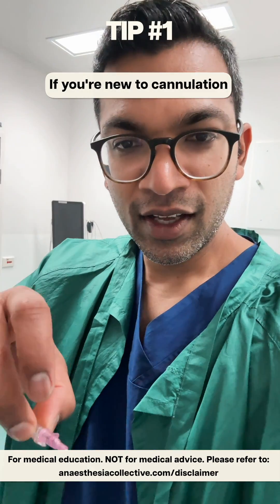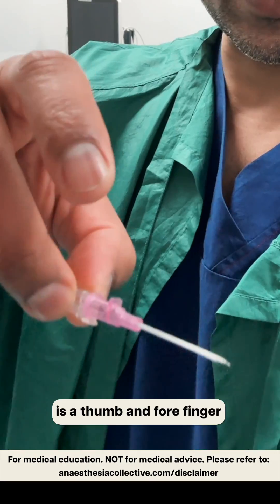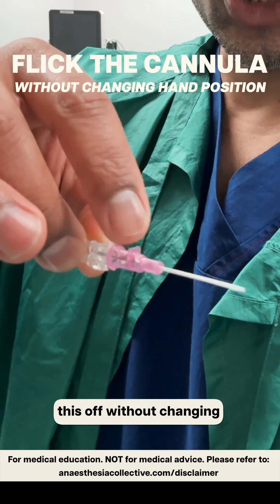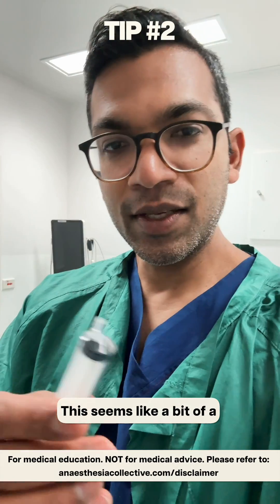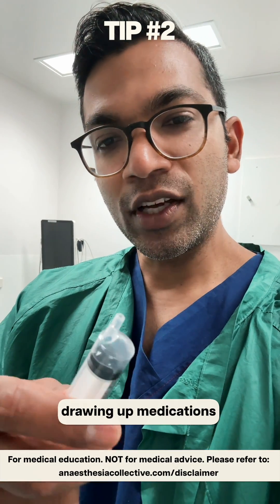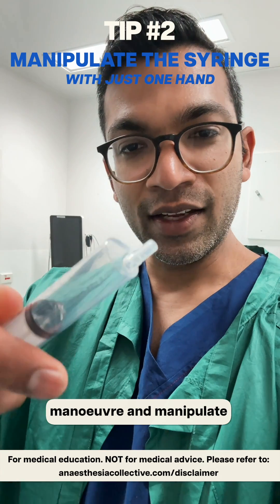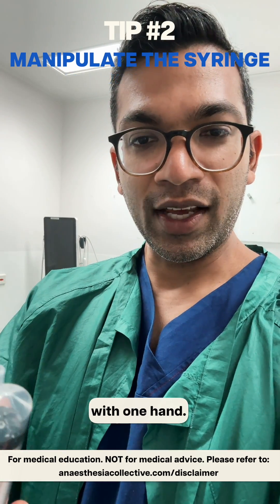If you need a cannulation, having this kind of grip — the thumb and forefinger — but then being able to flick this off without changing your hand position is really valuable. This seems like a subtle skill, but when you're drawing out medications, you need to be able to maneuver and manipulate your syringe just with one hand.